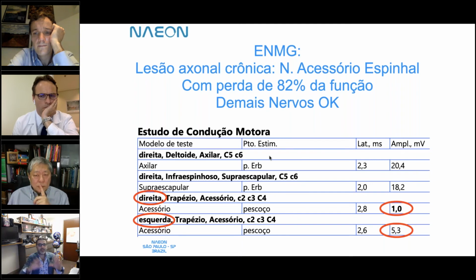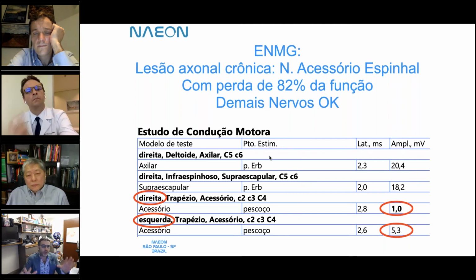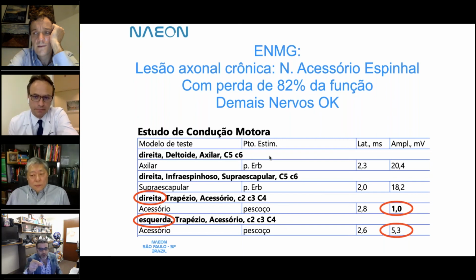But let's say the patient is worried. Regardless, I'm going to do the scapulopexy through a very small, tiny incision at the tip of the scapula. This whole thing takes 10 minutes. You can see the latissimus, which you want to use. You can see the serratus, and you can examine it intra-op. You can take a quick video and examine it. It looks perfect. Then after surgery, you tell the patient the serratus is perfect.